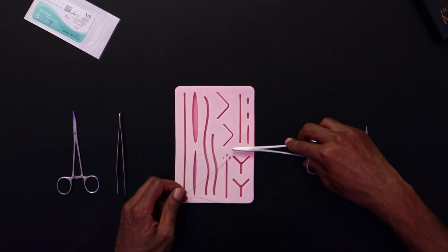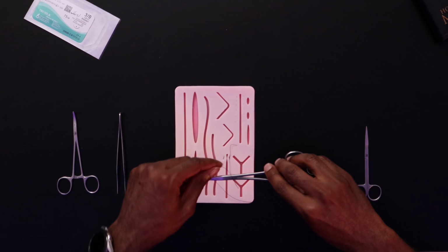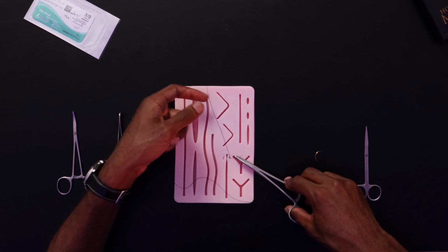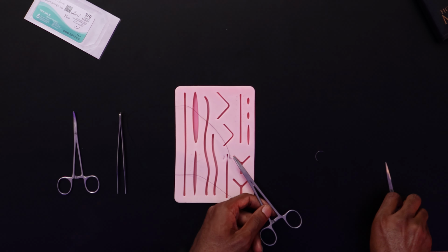Now we're going to tie off the suture in the same way that we have done for any suture technique that we use. Two throws over the needle holder, and tighten. One throw in the opposite direction. Cross the hands. And then one more throw back in the original direction. Now we'll cut the short thread.